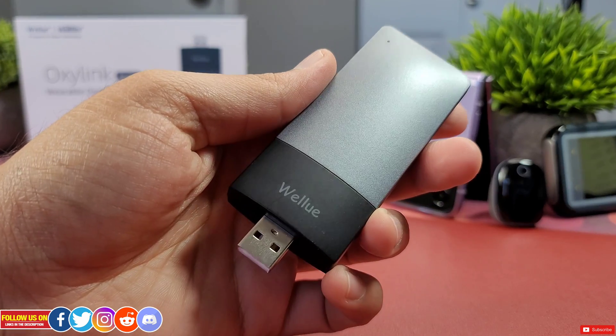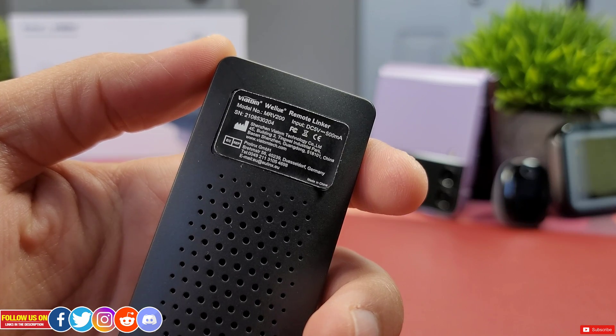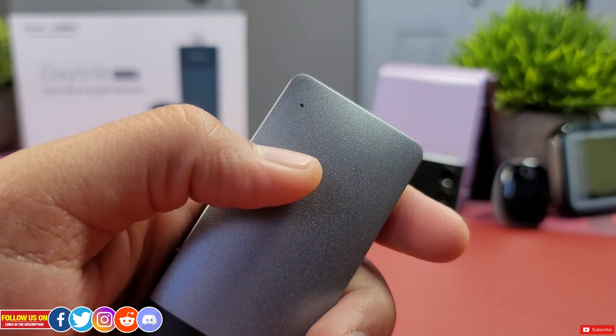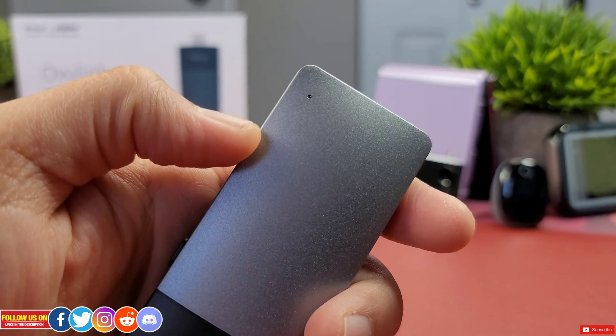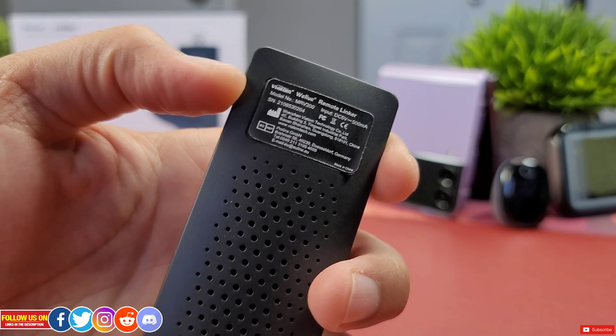The remote linker is like a Wi-Fi dongle or adapter and is plug-and-play — just plug it into any USB Type-A adapter and you're all set. There is a button on the right side, an LED indicator on the top left corner, and a few details at the back.